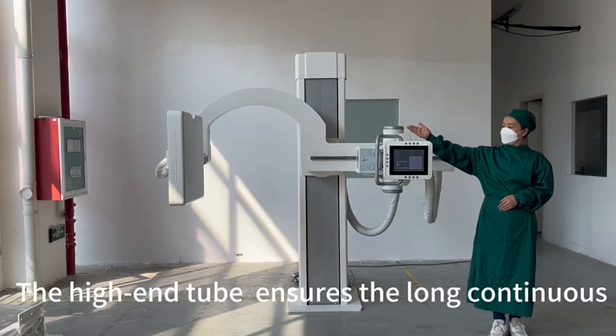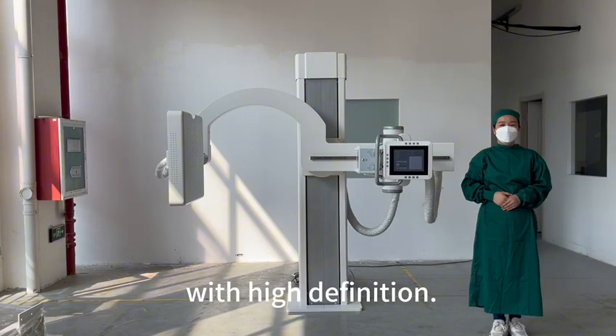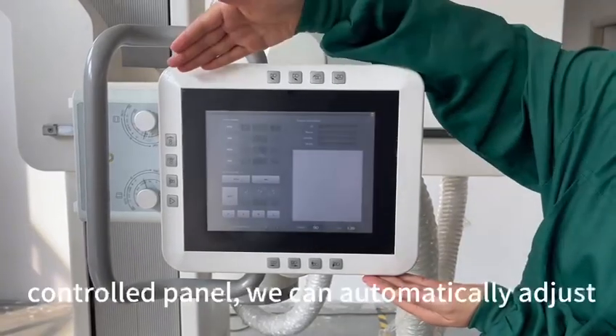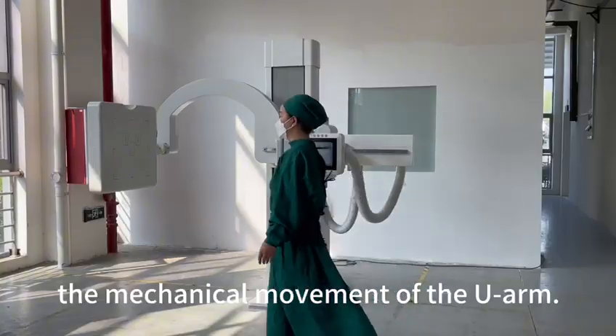The high-end tube ensures long continuous working hours and offers sharp images with high definition. Here we have a large 9.7-inch colorful control panel. We can automatically adjust the mechanical movement of the U-Arm.